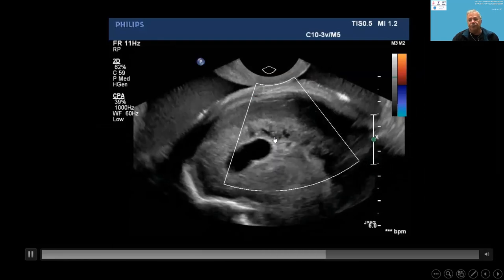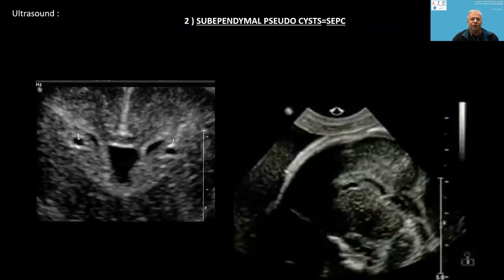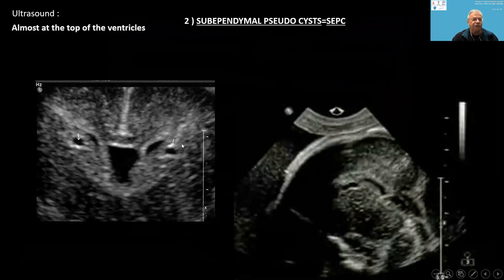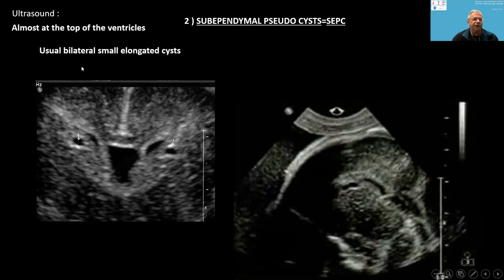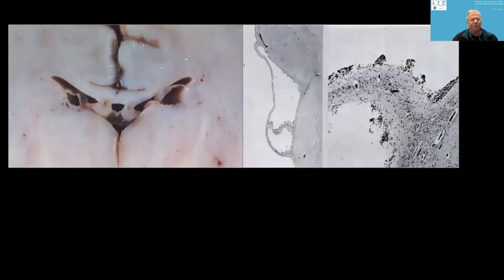The second group of cysts are the sub-ependymal pseudocysts. On ultrasound, they appear almost at the top of the ventricle in the frontal horns. This is a sagittal section. They are usually bilateral, small, and elongated, appearing in the third trimester.